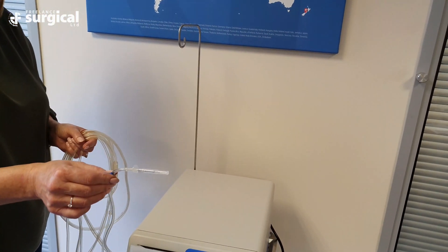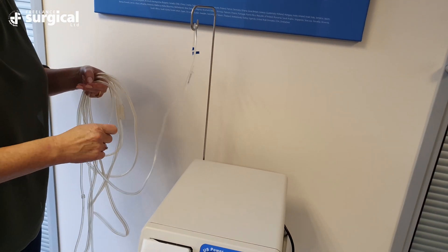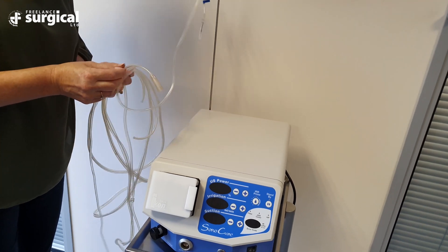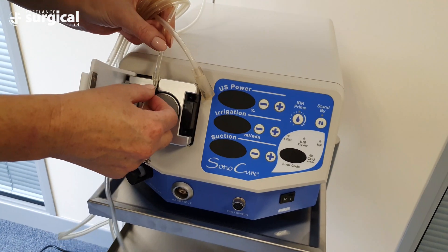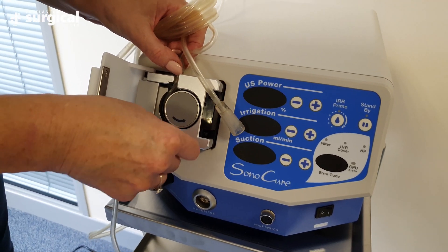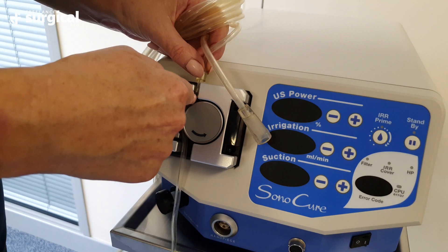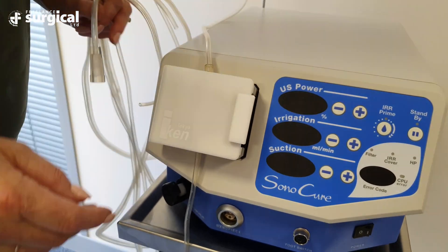Line one: connect the sharp into the fluid bag port. Locate the stopper on this line, open the door to the peristaltic pump and position the rubber stopper at the top of the peristaltic wheel to draw the saline solution from the fluid bag. Ensure that the door of the peristaltic pump is firmly shut once the tubing is in place.